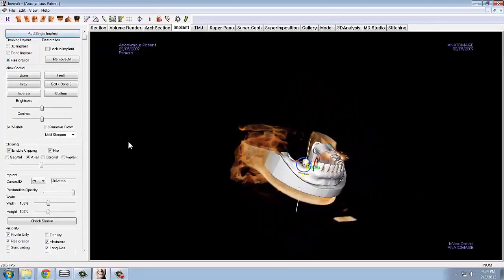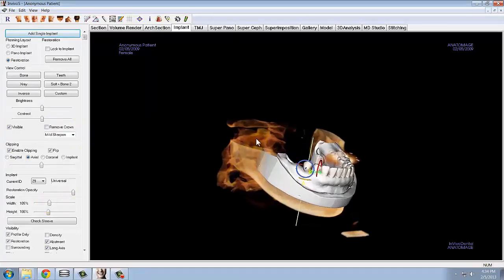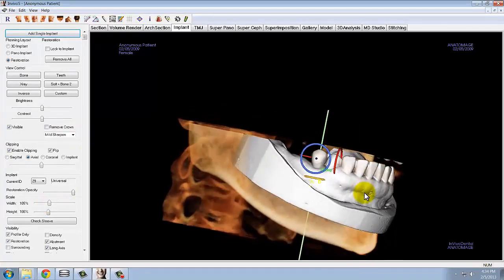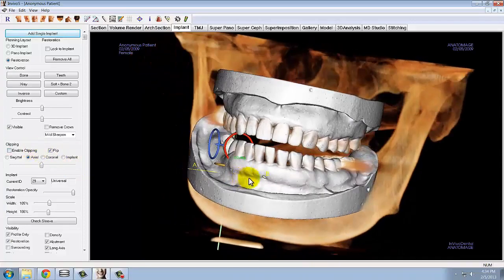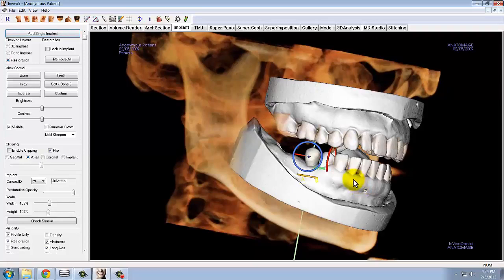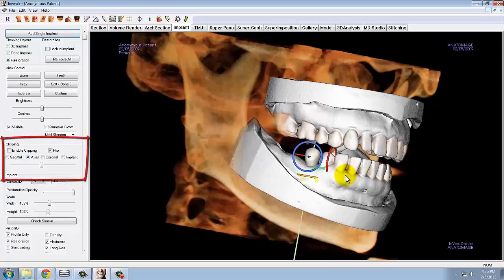Use the height and width tools in the control panel to adjust its size. Make sure that the restoration would fit in occlusion with its opposing tooth. When changing to the restoration view in the software, it automatically gives you a clipped axial view to provide an occlusal view of the patient. You can switch from this view by deselecting clipping in the control panel and using the preset orientations in the toolbar.